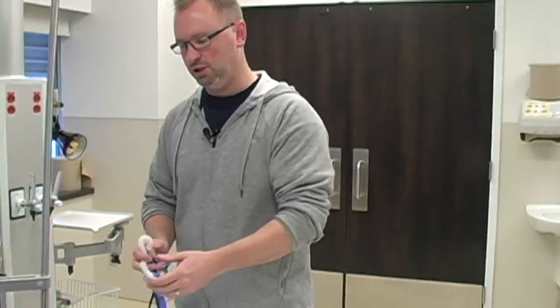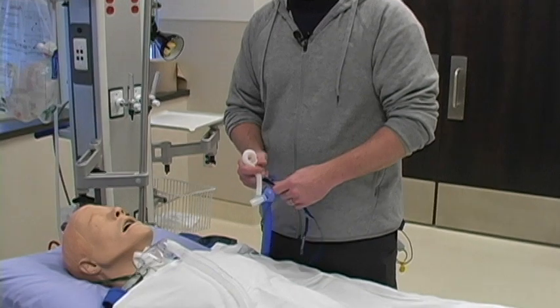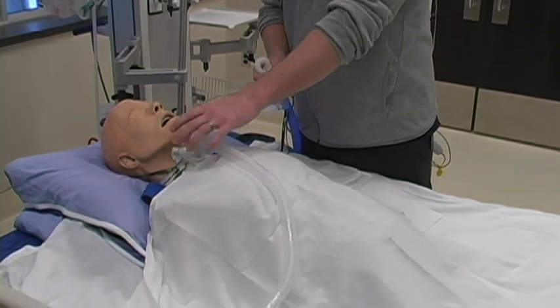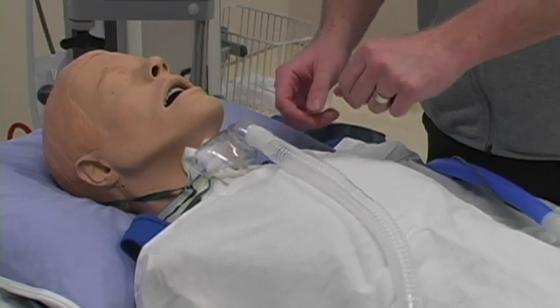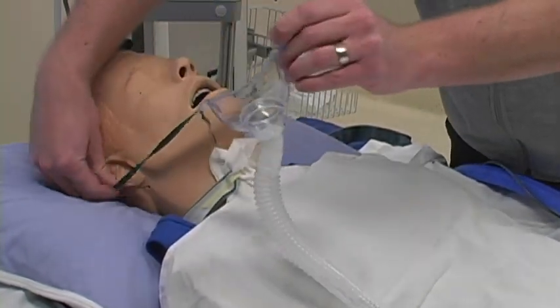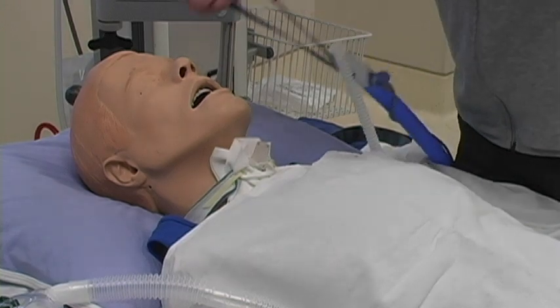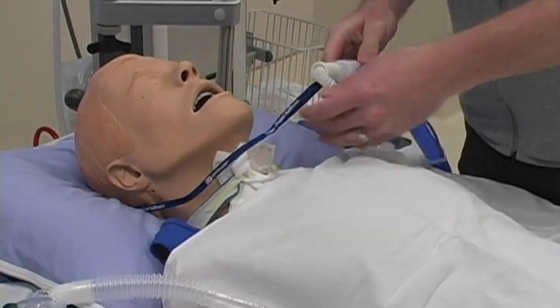We have our trach patient here. He's got our basic trach setup that we use in the hospital with our aerosol tubing and our trach mask. You can see the trach mask just sort of sits on his skin around the trach and provides some humidity through the setup. So if we take this off and wanted to put our patient on Optiflow, you would take the lanyard that we have here, place it around the patient's neck so when they get up and move around, it's sort of there with them.